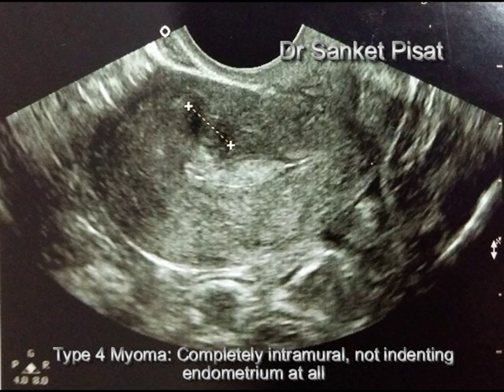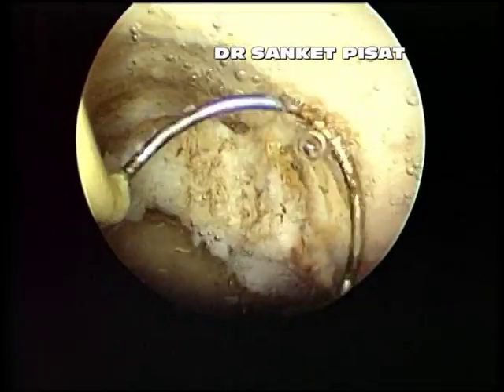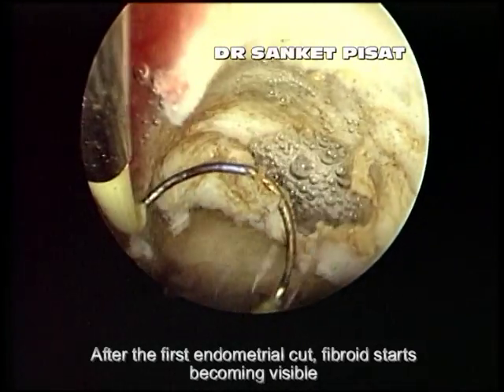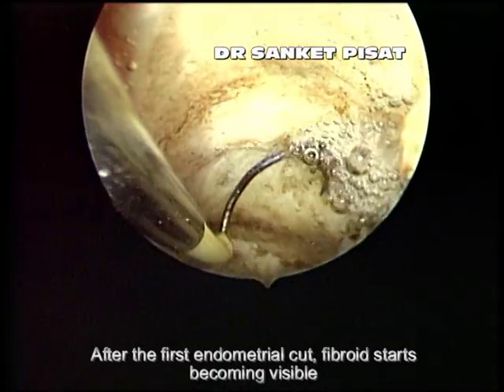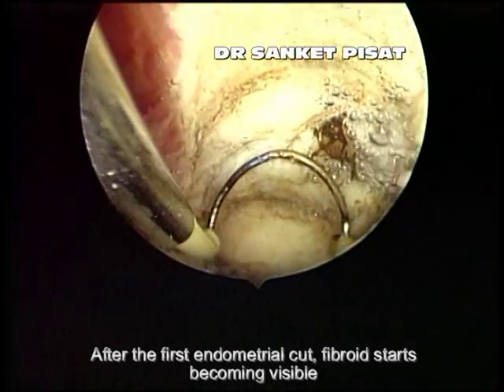This is a patient with a type 4 myoma, completely intramural and not indenting the endometrium. A good mapping of the fibroid by ultrasound clearly elicits the depth of the fibroid in the endometrium as well as the safety margin available up to the serosa. It is only after the first 1 or 2 cuts on the endometrium that the fibroid starts becoming visible as a diffuse elevation over the anterior wall.